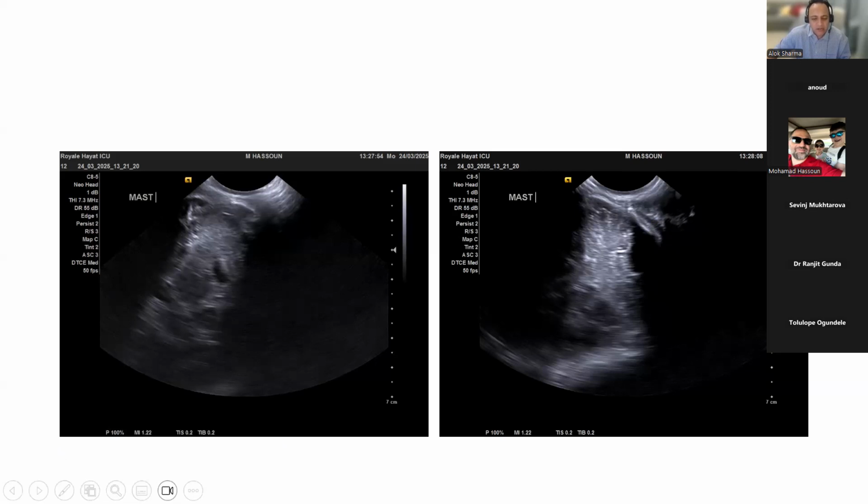Were you doing it from the left or the right? From the left. So that is basically the left cerebellar hemisphere. This is the cisterna magna coming into view at the back there. Can you just annotate, Dr. Albert is not coming. My apologies. Yeah, sure. I'll just take my drawing.